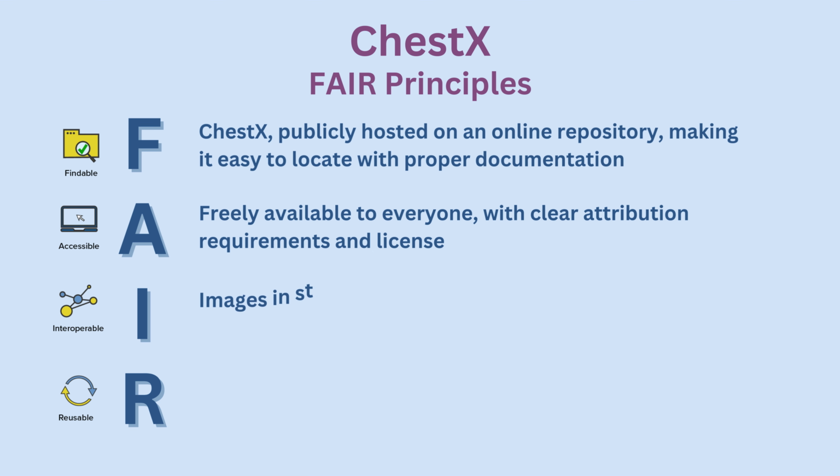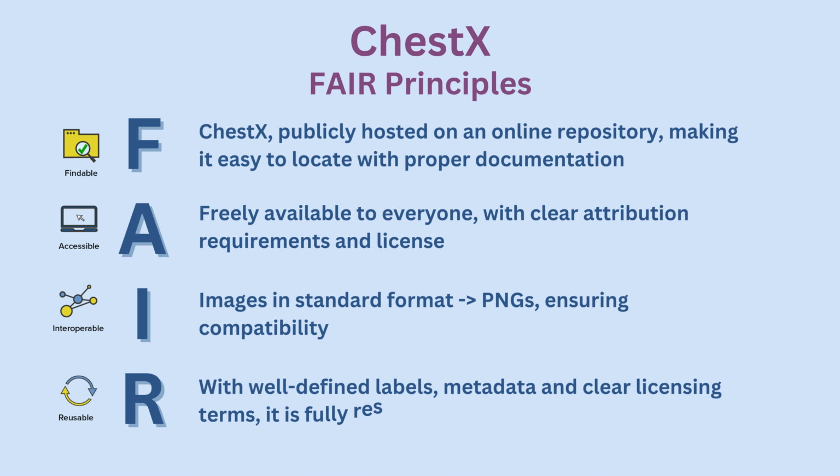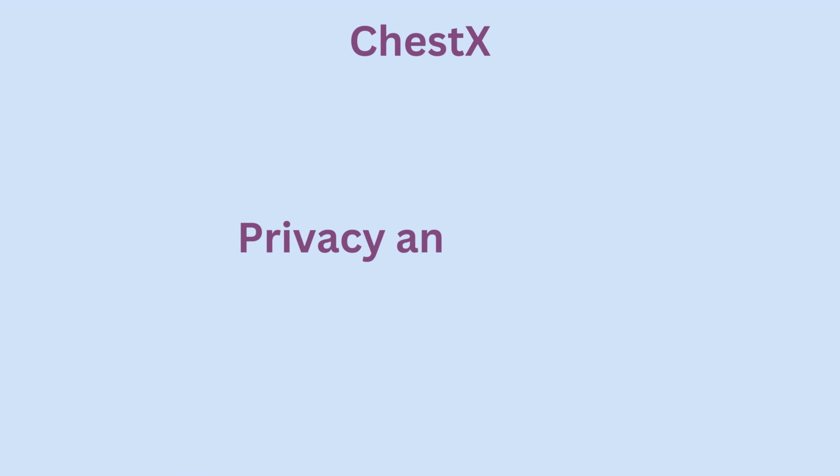ChestX provides images in standard formats like PNG, ensuring compatibility with various tools and platforms. Hence it is interoperable. ChestX data was released to drive further research with well-defined disease labels, detailed metadata descriptions, and clear licensing terms. These features ensure the dataset is reusable, enabling researchers to understand, adapt, and extend it for broader scientific endeavors.